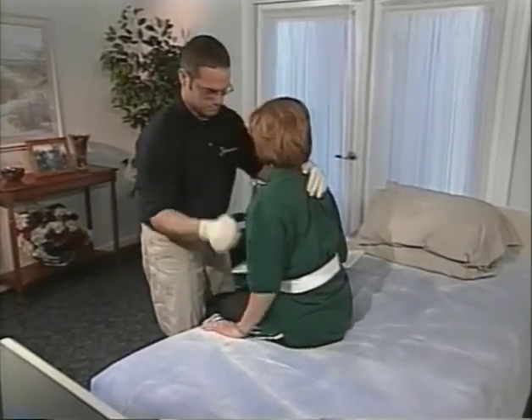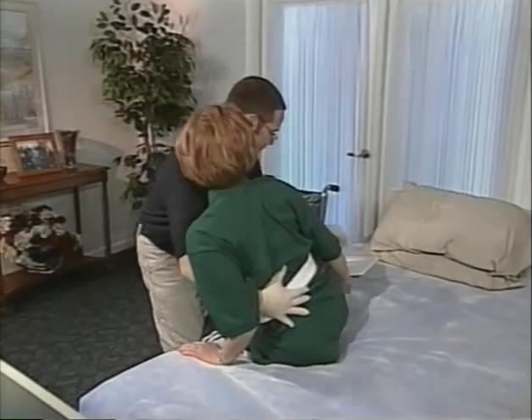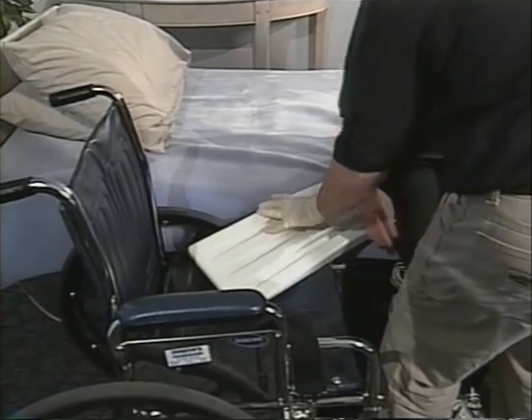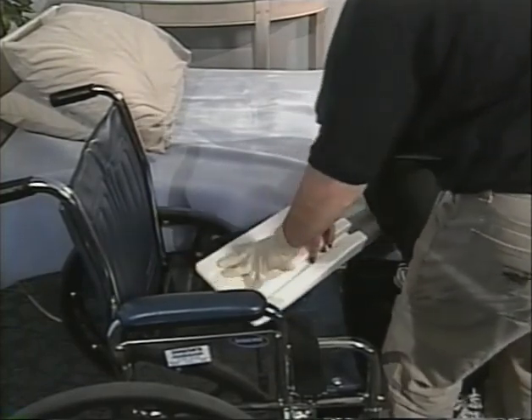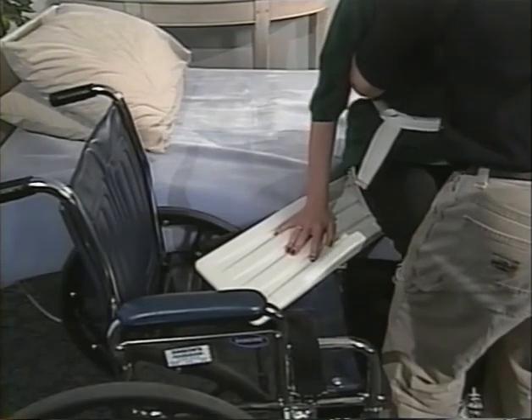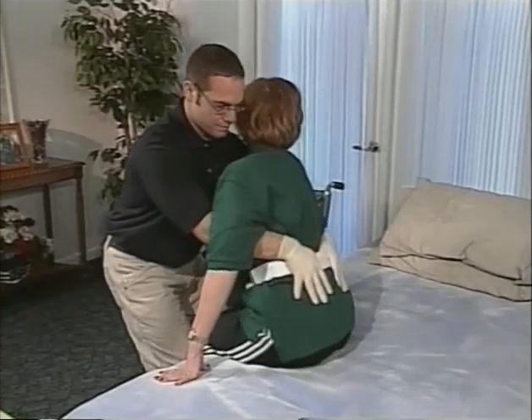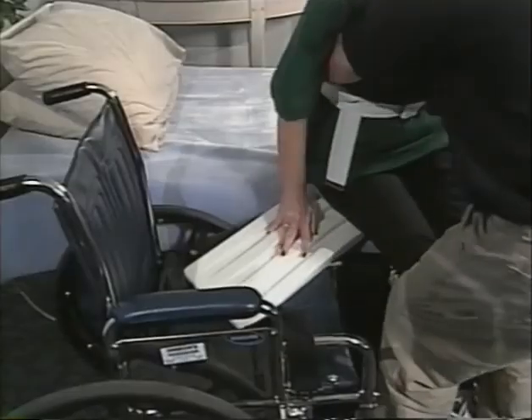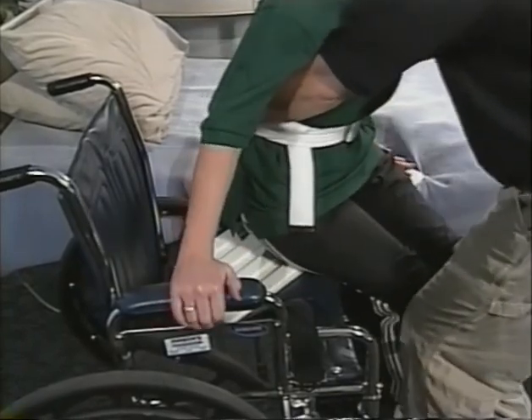Position the sliding board by using the cradle technique to unweight the hip closest to the surface you are moving towards. Place one end of the sliding board under the buttock region and the other end on the surface you are moving to. Repeat the previous steps from the squat pivot transfer. However, as you pivot, slide their buttocks across the board instead of lifting their buttocks up.